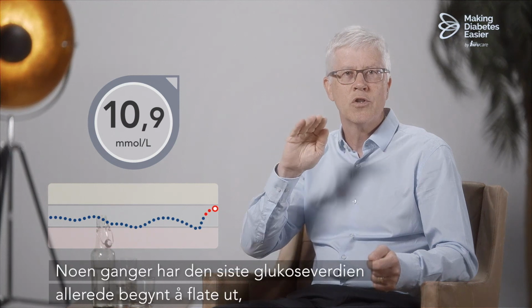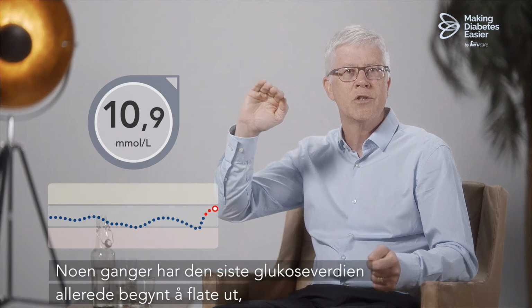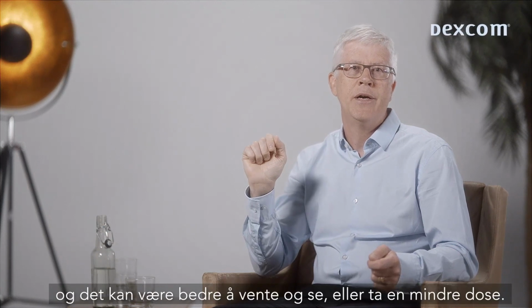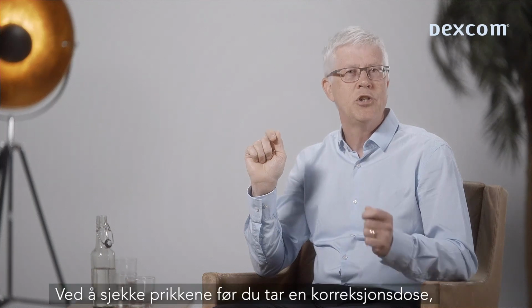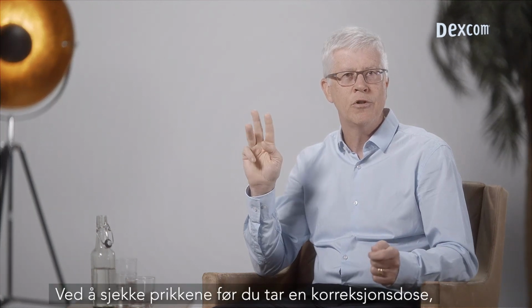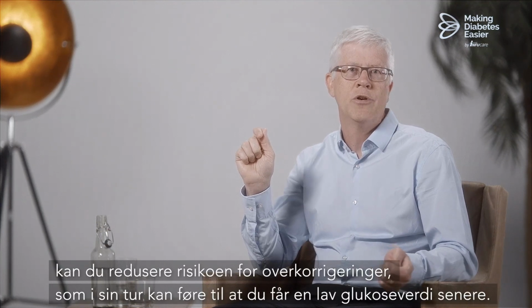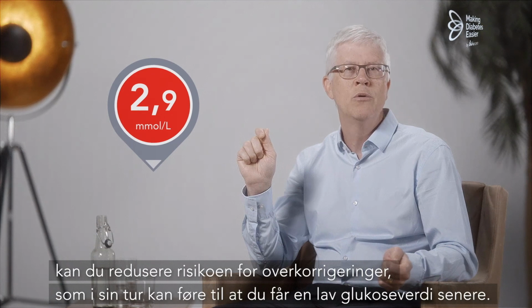Sometimes the last glucose value has already started to level, and it may be better to wait and see or take a smaller dose. By checking the dots before taking a corrective dose, you can reduce the risk of overcorrections, which in turn may cause you a low glucose value later.